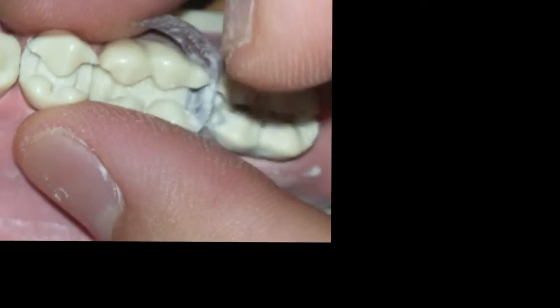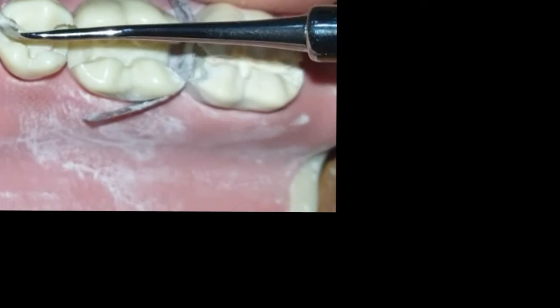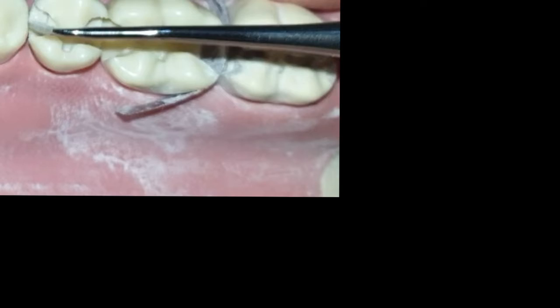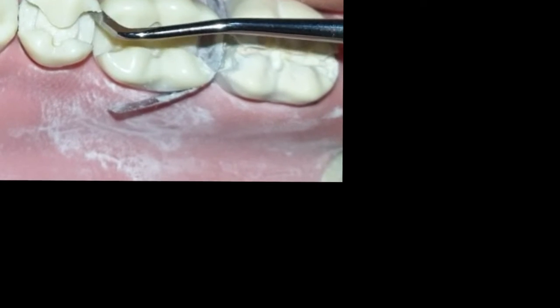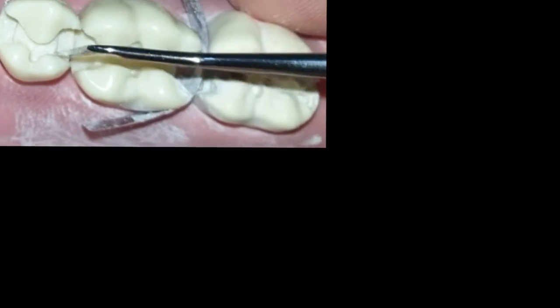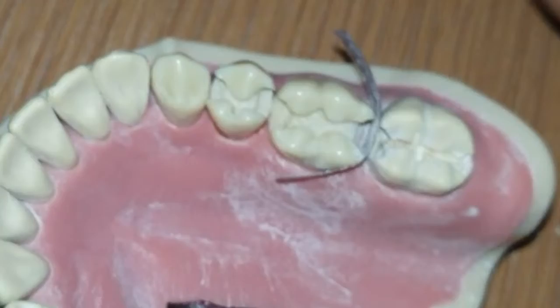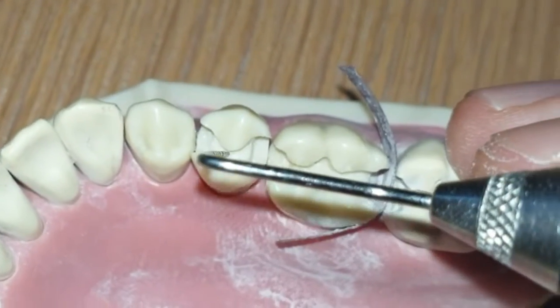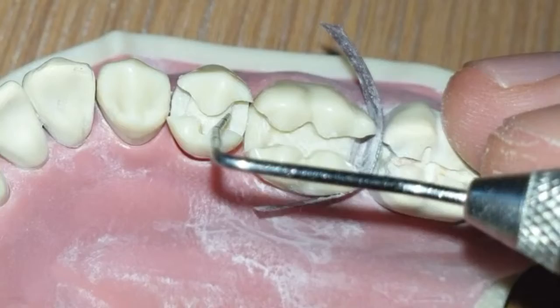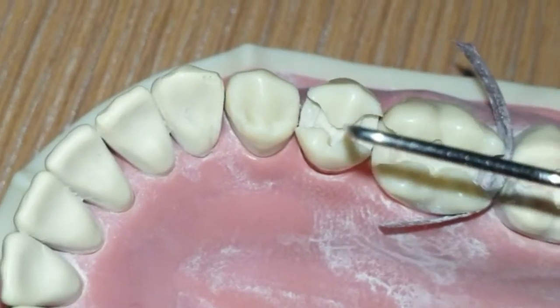Aside from the margin projection here, the irregularity here, and also the contact removal — aside from that, yeah, it is fine I think. If you have anything else that I need to improve, you can tell me. That'll really help me.